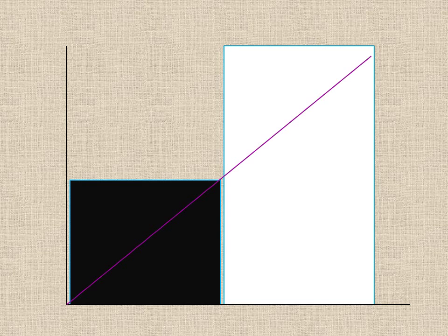This means that the pixels would only be black or white and would give an incredibly high contrast picture, which would be useful for things like vascular scanning, where you're just trying to differentiate between the inside and outside of a blood vessel.